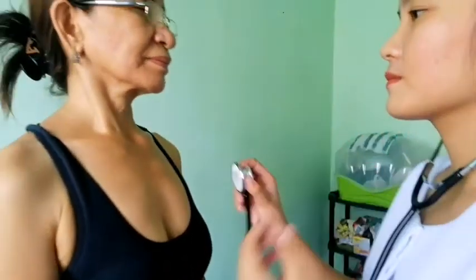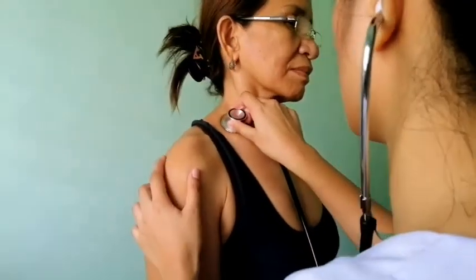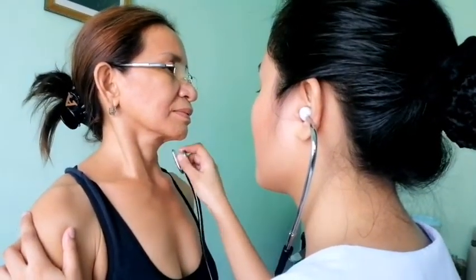Next, auscultate the trachea. The normal finding is bronchial and tubular breath sounds, while the abnormal finding is adventitious breath sounds. Next, auscultate the anterior thorax using the systematic zigzag procedure used in percussing the anterior thorax.